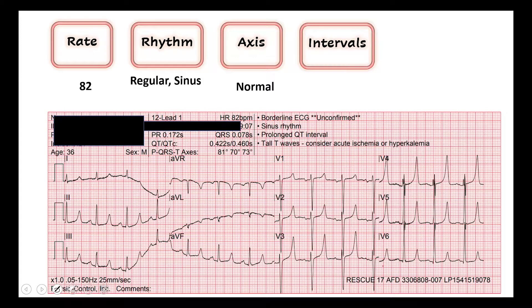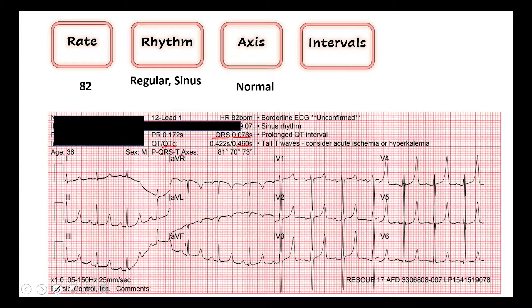Moving on to our intervals, we look at our QRS interval. We want that to be less than 120 — we're at 78 milliseconds here. That's good, a nice narrow QRS complex. Then we look at our QTc. Anything greater than 450 is considered prolonged; 500 is where we really start to get concerned about risk for spontaneous dysrhythmia. So technically this is a prolonged QT. We don't need to do anything aggressively right now, but it's something to take note of as you're thinking about treatments based on patient presentation. Our intervals generally look okay.